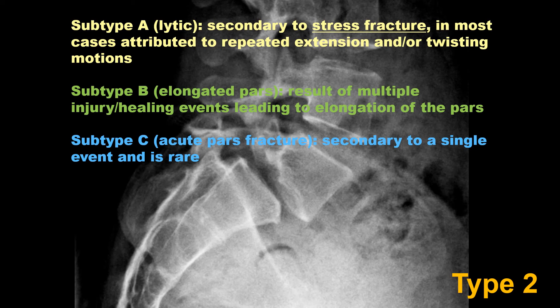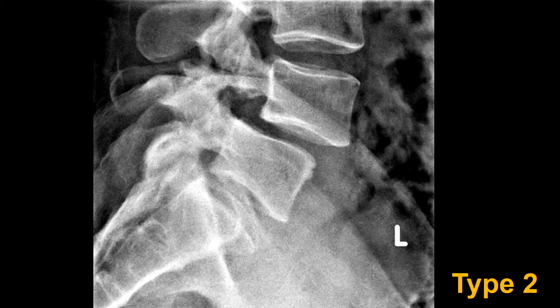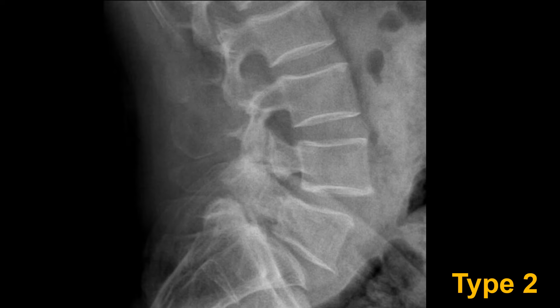Another example of a type 2 isthmic spondylolisthesis showing anterior translation, pars defect, loss of disc height, and spinous process where it should be. In this example we have two isthmic spondylolistheses at L4 and at L5, both grade one possibly grade two. The shape of the L5 vertebral body becoming trapezoidal is not a good sign and may be indicative of instability.